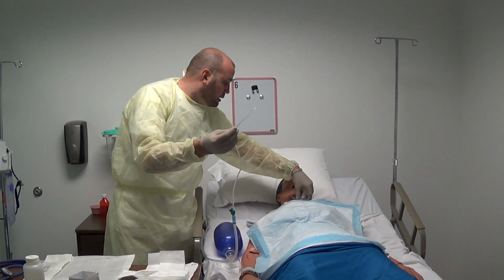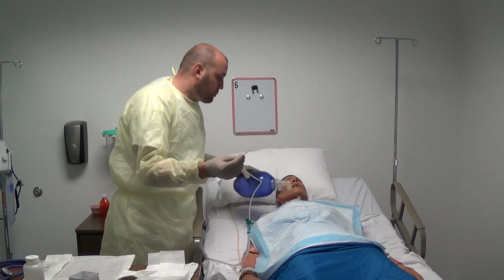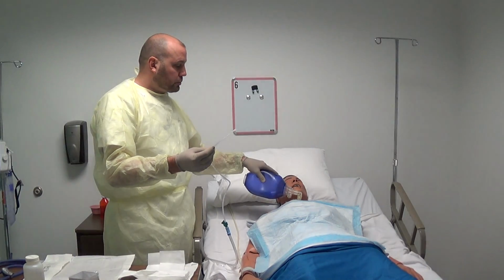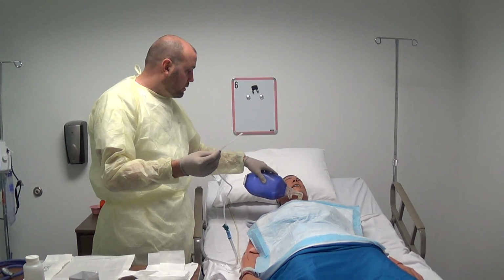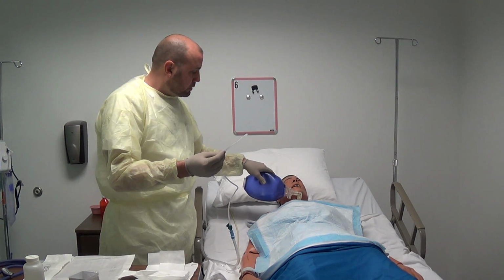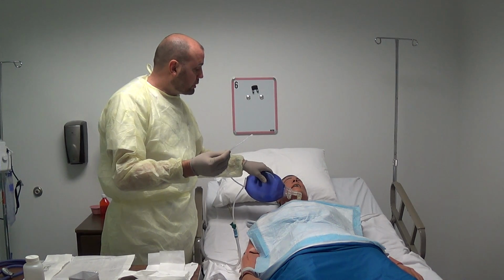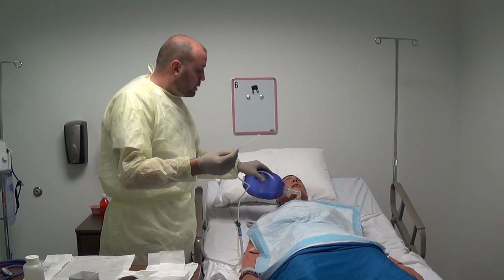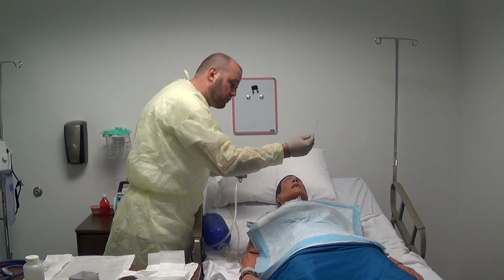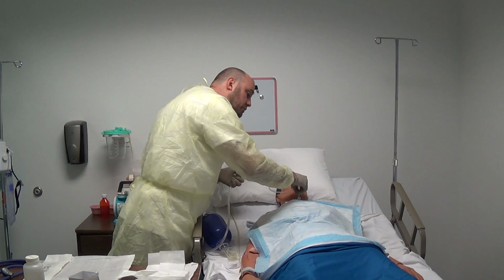Okay. I'll move the oxygen from the patient, hyperventilate the patient, working with the patient's respiration. So I want to give 3 to 5 Ambu assisted respirations. Okay, I see that the pulse ox has gone up to 94, but there are still tracheal secretions. I'll begin to advance the catheter without suction until I meet resistance.